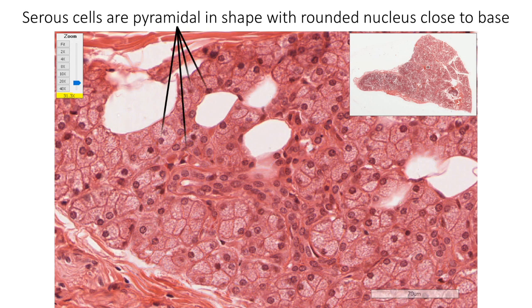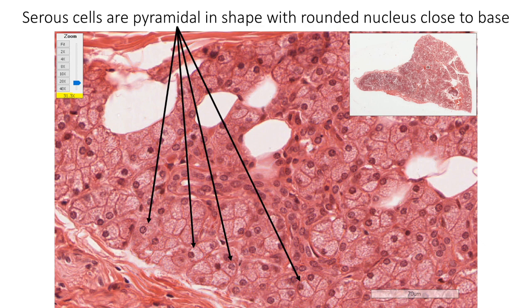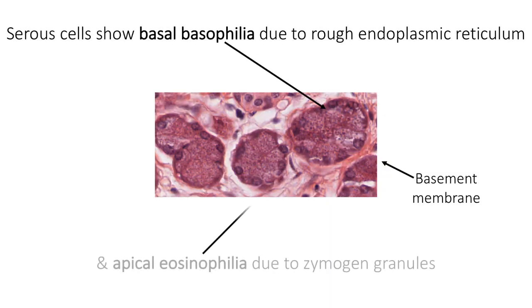Secretory end pieces of the acini are of three types: serous type, mucous acini, and the mixed acinus. Serous acini are usually spherical in shape and are lined by protein-secreting serous cells. Serous cells are pyramidal in shape with a rounded nucleus close to the base, as shown by the arrows here. Serous cells show biphasic staining — basal basophilia and apical eosinophilia. The presence of rough endoplasmic reticulum and free ribosomes results in the basophilic staining of the basal cytoplasm, whereas zymogen granules result in acidophilic staining of the apical cytoplasm.